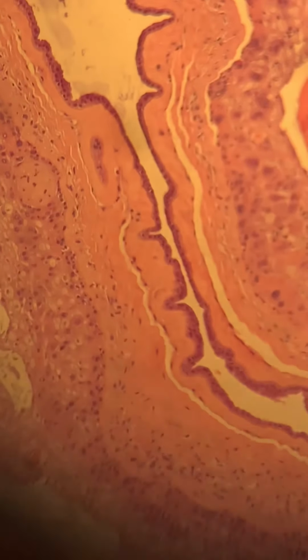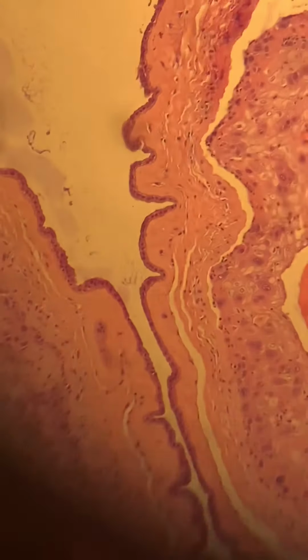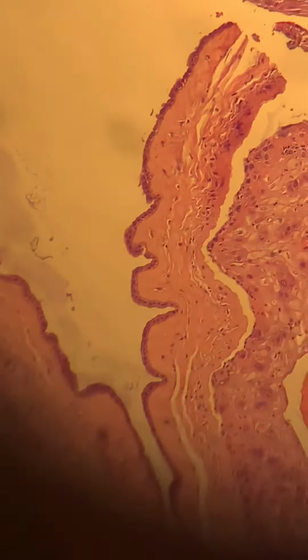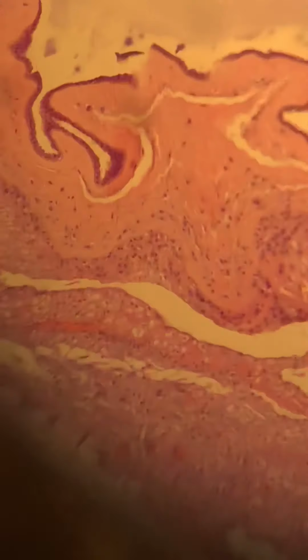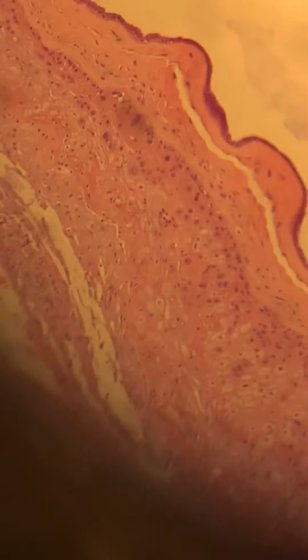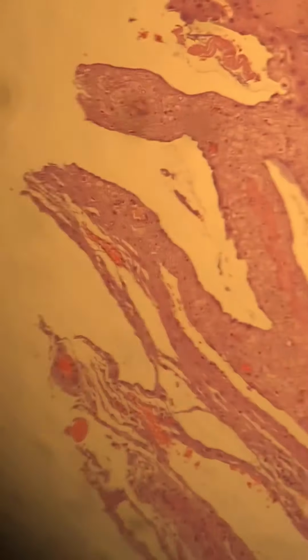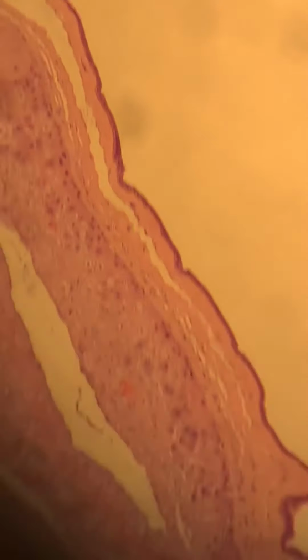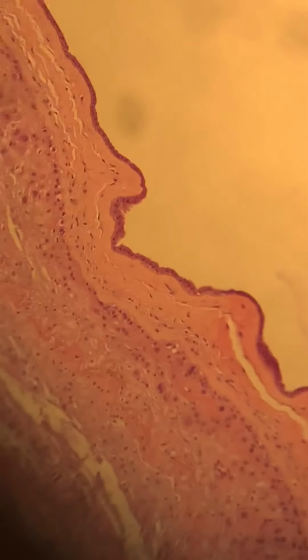And even on some of the other areas, if I can keep it in focus, it's real difficult with this little gadget I got, but you can see some meconium histiocytosis here. And you can see the early evidence of early acute chorioamnionitis here. Very early though. You will see it's a little more involved with twin B. So I'm going to end this video and go to the placental body from twin A.